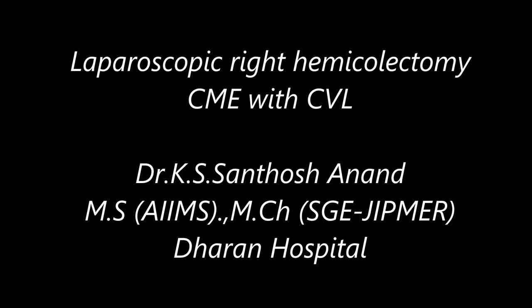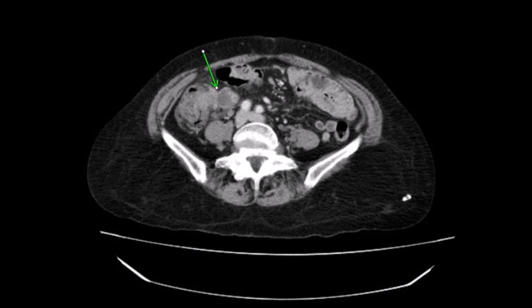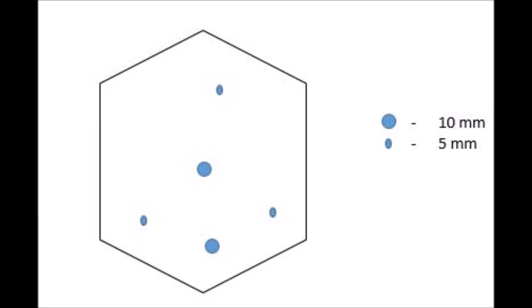We are seeing a laparoscopic right hemicolectomy case with complete mesocolic excision and central vascular ligation, which is D3 lymphadenectomy for oncological benefits. The patient is a 68-year-old female with a growth in the cecum with bulky ileocolic nodes as shown in this picture.